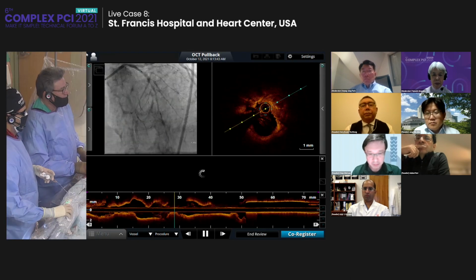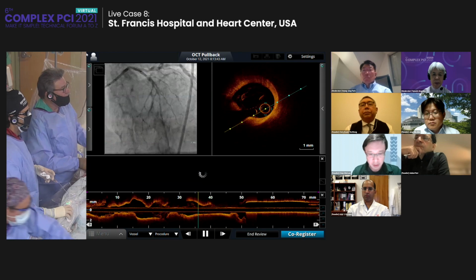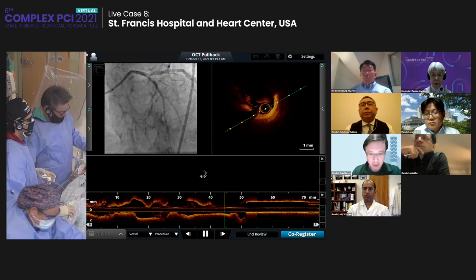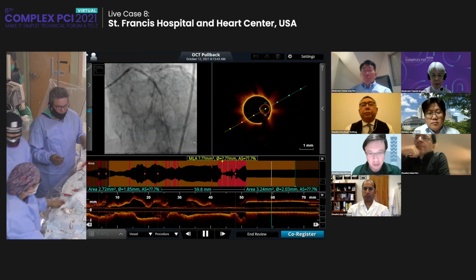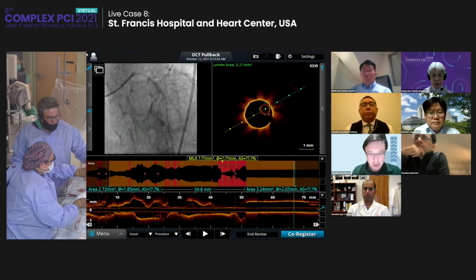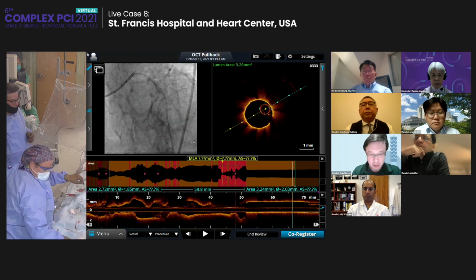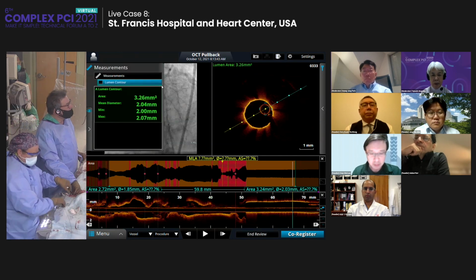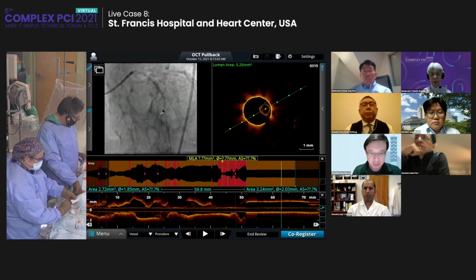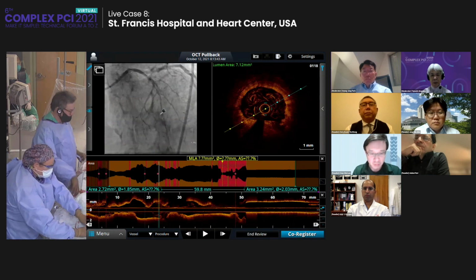So you see we have very good fracture. And sometimes what we measure as our stent length changes with the Shockwave, because you can get longitudinal fracture, and the size can change as well because you sort of release a girdle. So what we're going to do here is just start off at the distal end.